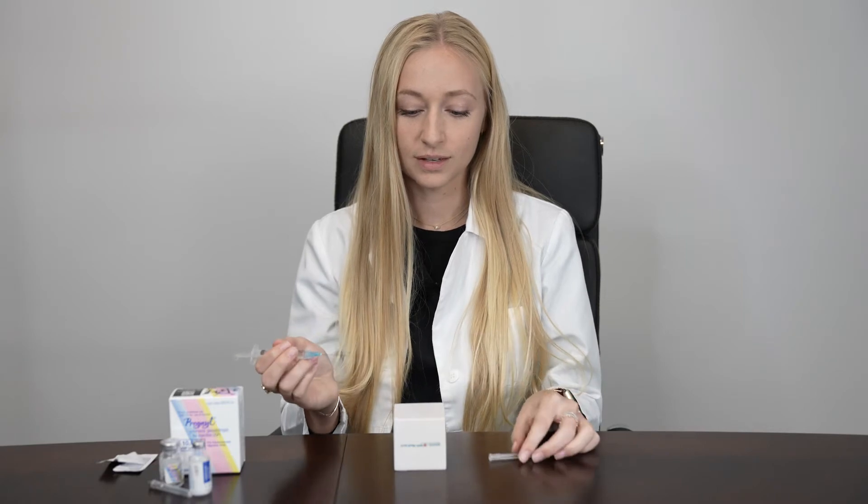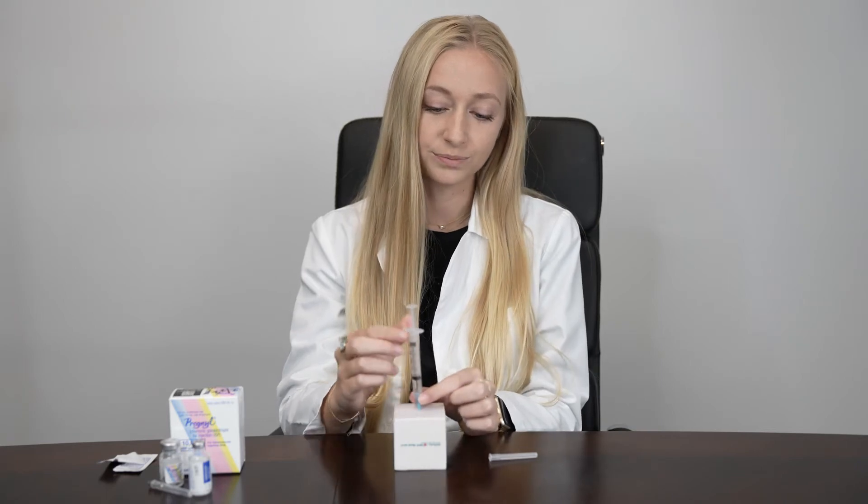Unlike your other injections, this will be an intramuscular injection in the upper outer quadrant of your buttocks. Wipe the skin with alcohol, spread the skin apart, and then inject at a 90 degree angle all the way down until the hub of the needle. The first thing you want to do is aspirate, which means to gently pull back on the plunger of the syringe. If you see a little air bubble or nothing at all, you're good to inject the 1cc.